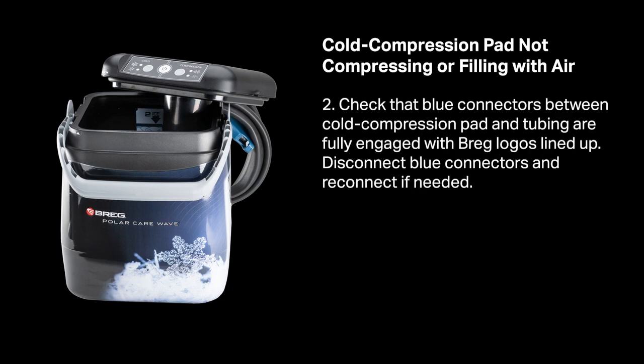Check that the blue connector between the cold compression pad and tubing are fully engaged with the Breg logos lined up. Disconnect the blue connectors and reconnect if needed.